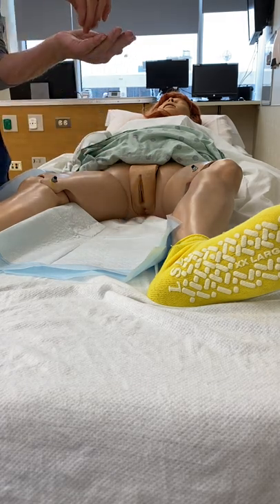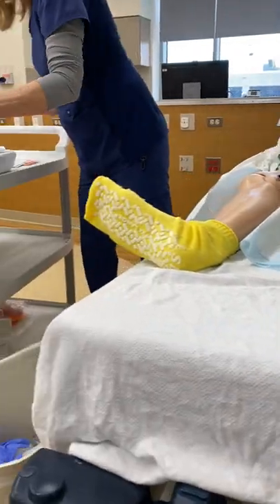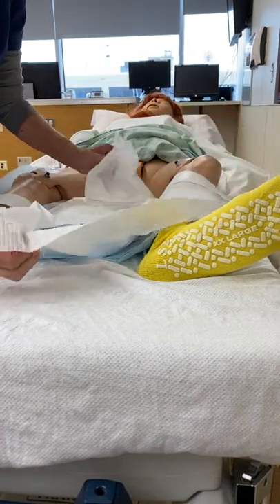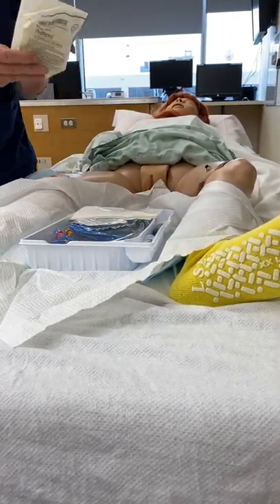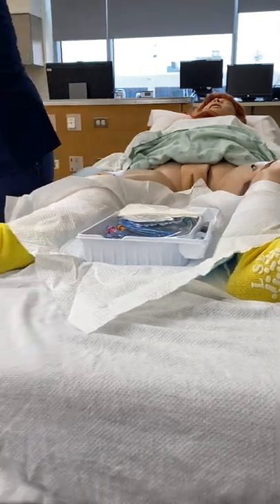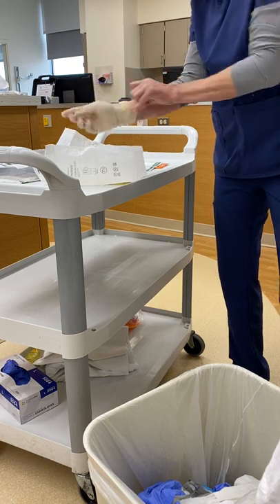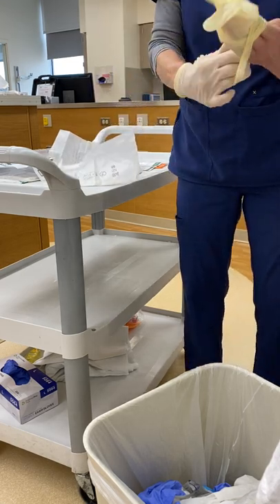There's a little Purell pack in the tray to clean the hands before donning sterile gloves. Orient the field towards the insertion site, then open it very carefully, touching only the outside. The next thing is to put on sterile gloves. I recommend bringing an extra pair in case these are too tight or break. Turn and do this on the bedside table, not on the field — be careful not to contaminate. Hold underneath and make sure you don't contaminate.